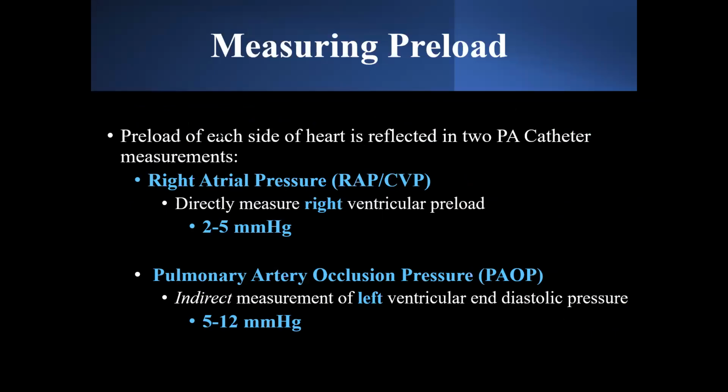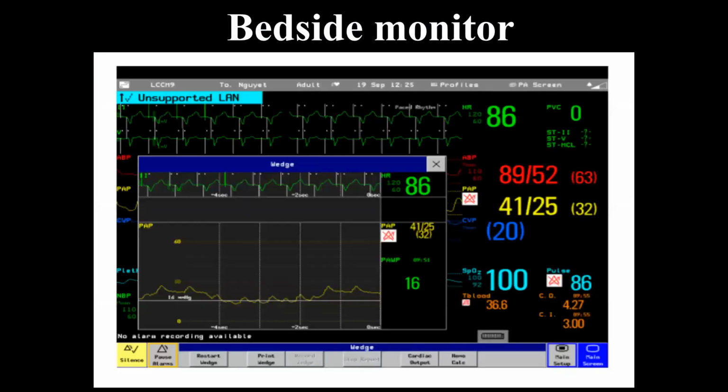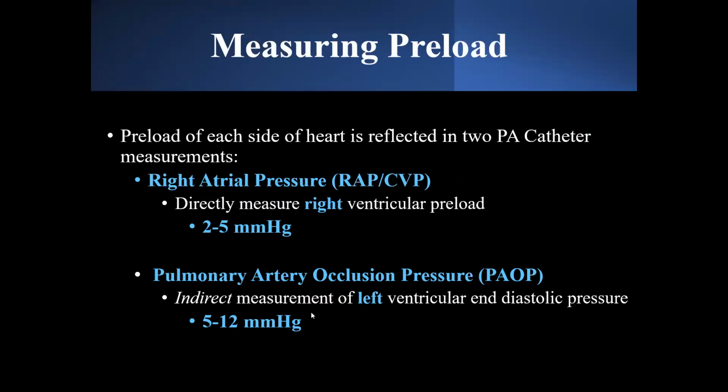Lorraine? Yes. Was 16 the wedge? Yes. So let me go back right here. Yep. I wanted that picture, and it even says wedge up here. I wanted that picture to show you. This is what you'll see continuously. I've got to inflate the balloon to do this wedge. And if a patient's breathing, remember I said end expiratory, so breathe in and exhale. We're going to measure it down here on end exhalation. Breathe in, exhale. So we want an average at end expiration.